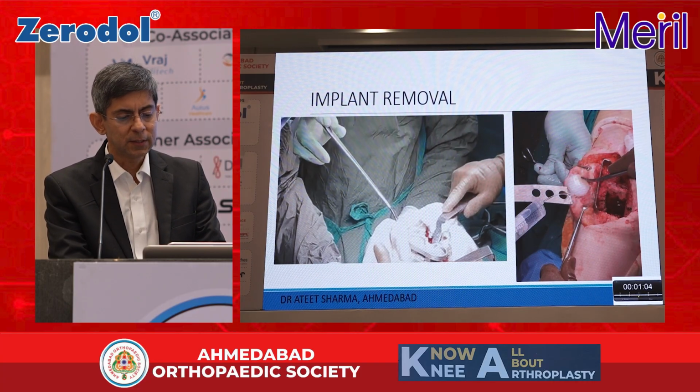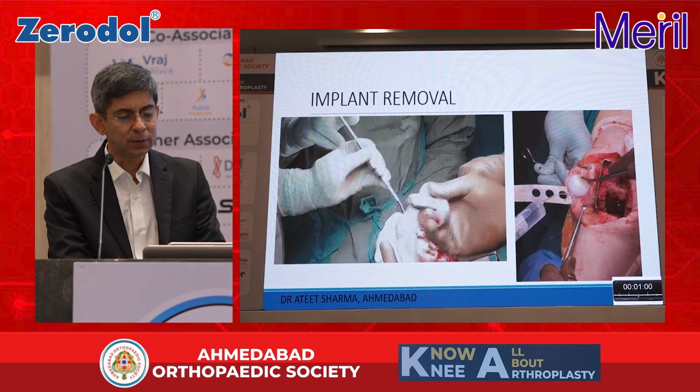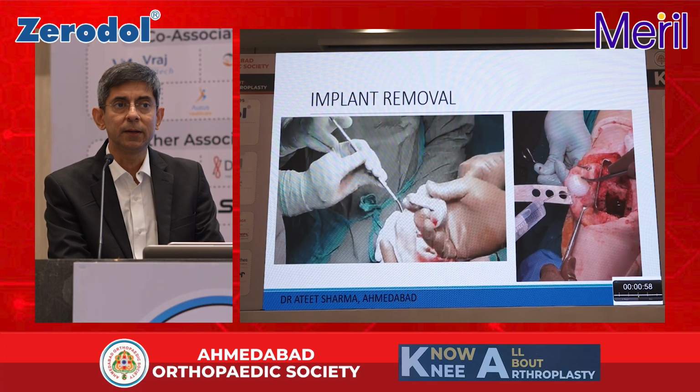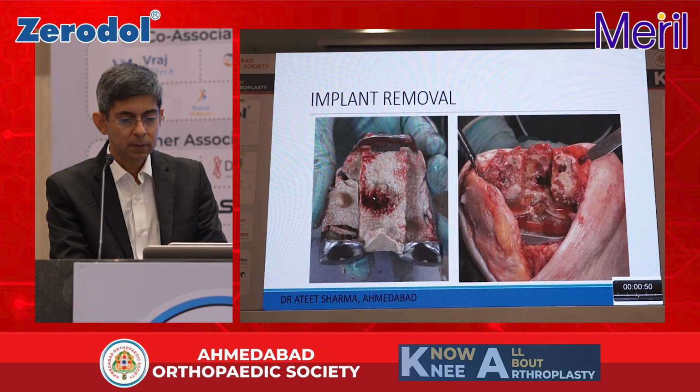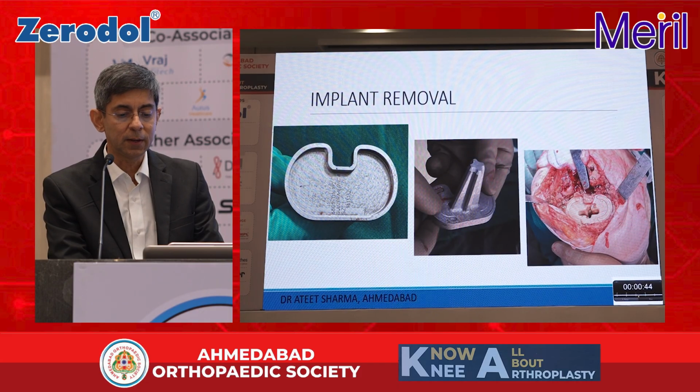The importance here is that there is no cement on the back side of the tibial base plate. Like the studies said, that is the weakest interface, the implant cement interface. In the femoral implant, the cement is almost on the implant, with good adhesion, while in the case of the tibia, almost all of it is with the bone, not with the implant.